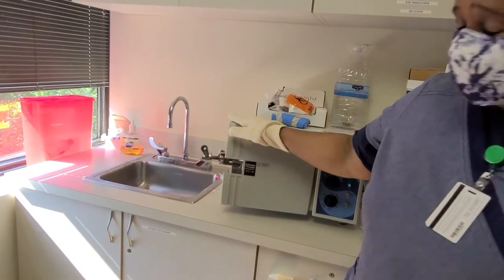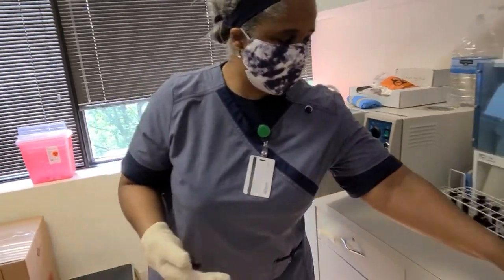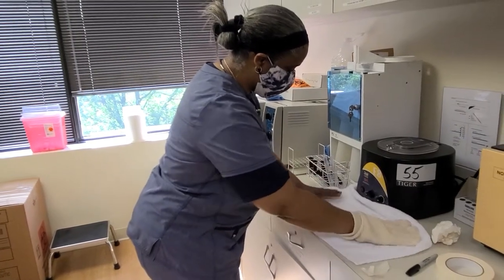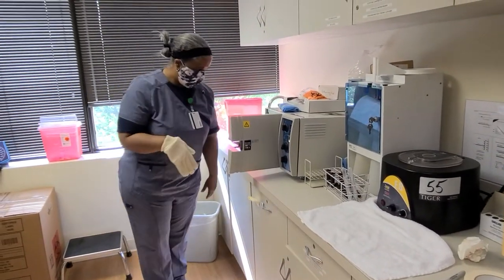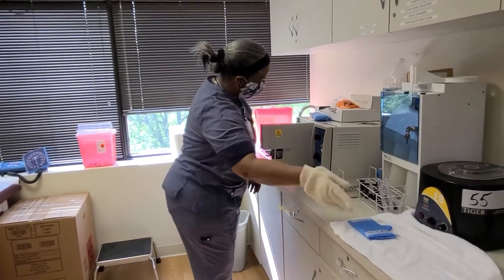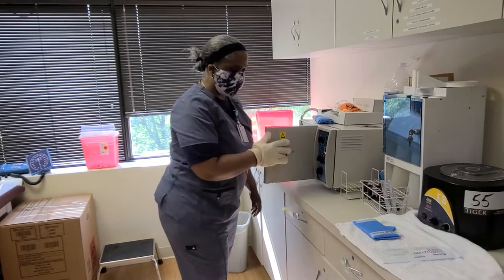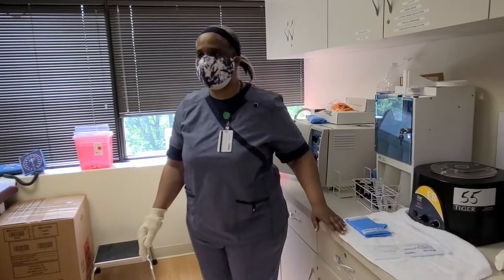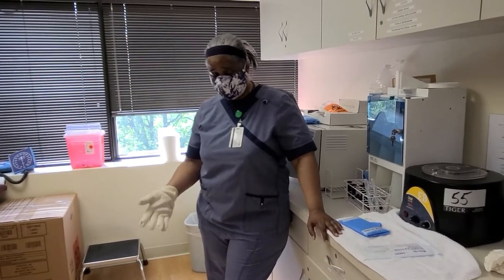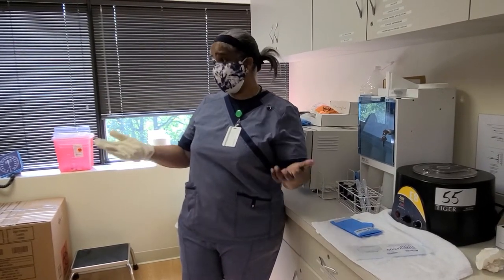Once I'm done, it's going to be pretty wet. Then I'm going to use my utility glove and get a towel, because I don't want to put it right on the counter. Sometimes it's so hot that it could mess the counter up or do some other type of harm. Then I take my instruments out when they're autoclaved and put them on the towel, and hopefully it's not too wet. If I start to see that it's too wet, it's time to service my autoclave or clean it. There is a solution you can put in here to get all the corrosion or whatever else out, or sometimes you just need to do what? Maintenance, okay?